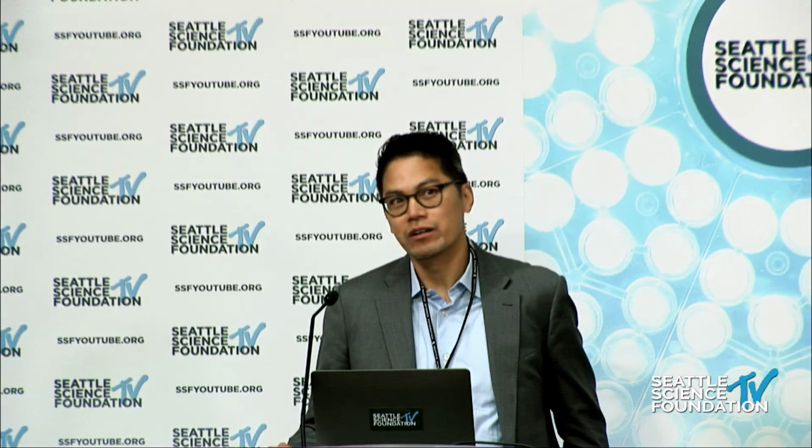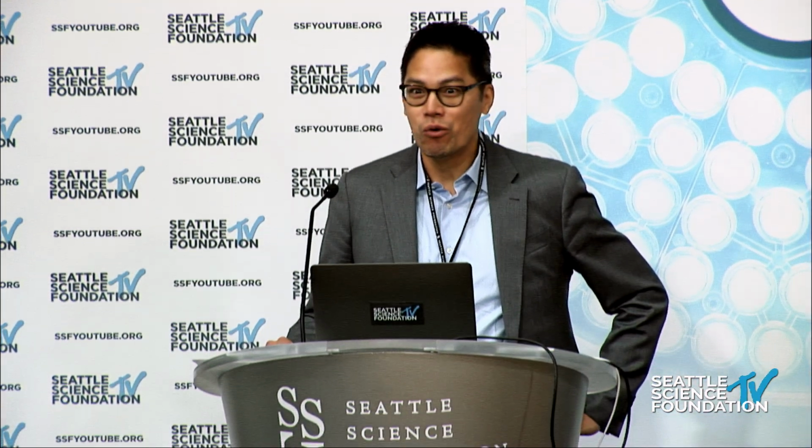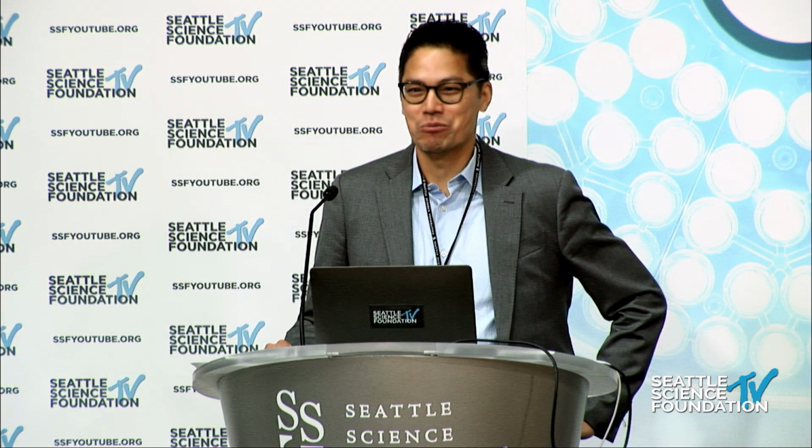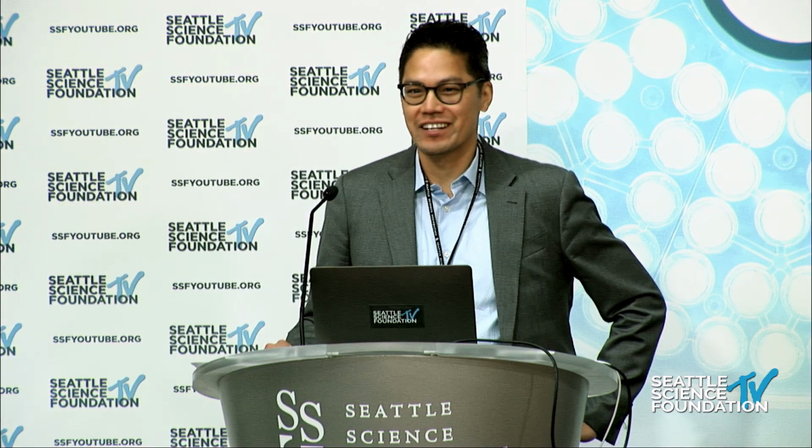And the last thing I'd say is there's yet a further trade-off, which may be in terms of infection susceptibility. Cobalt chrome was one and stainless would be the other, that I've had late infections become clinically significant, whereas I never saw that around titanium, I don't think. Yeah, I'd be interested to hear more about the MORE rod, and learn more about the characteristics of that and how it's used.